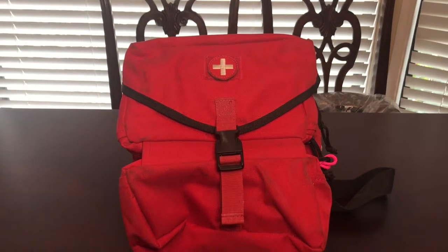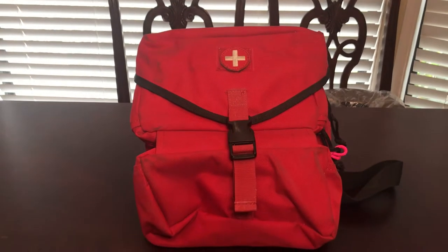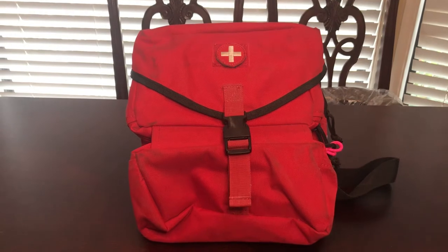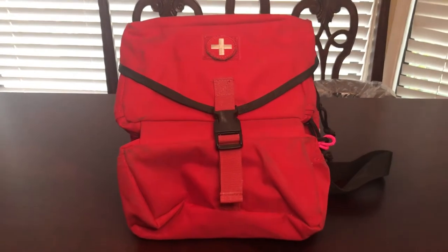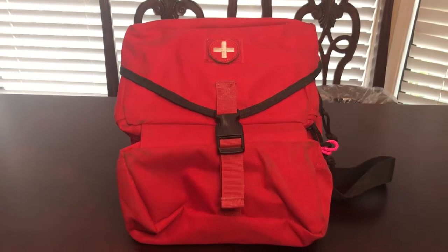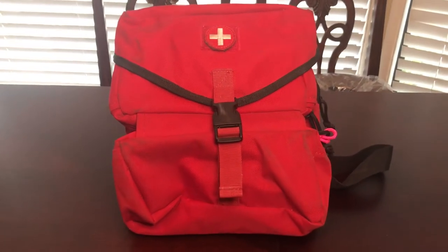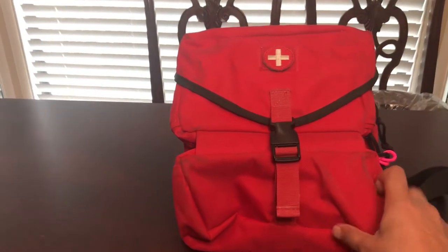I want to do a quick video on my travel first aid kit. I take this whenever I go camping, throw it in the back of the four-wheel drive. It's a light to medium duty first aid kit for bigger cuts and injuries, not just a band-aid boo-boo type kit.